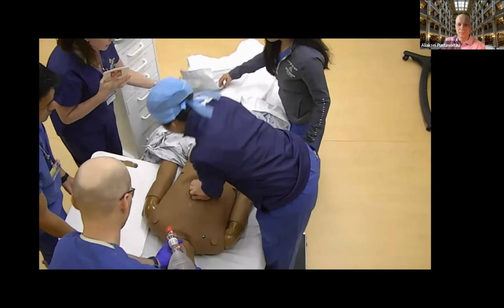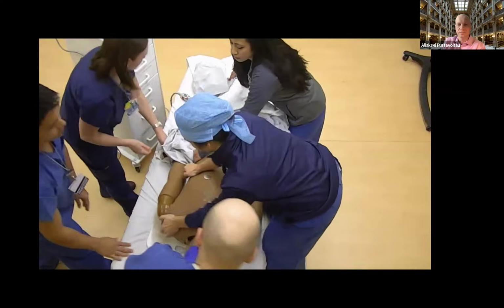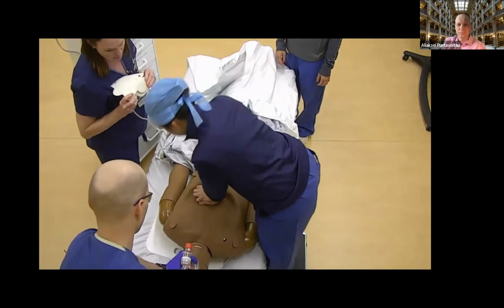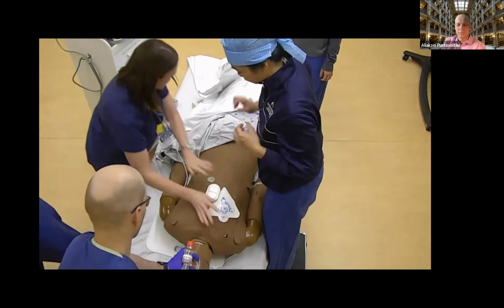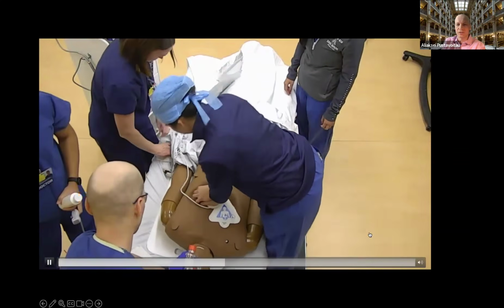Backward, back side ready, on your count. Yep, roll towards Rika. 1, 2, 3, roll. Good, give me compression. With the front pad, we're gonna put it out in 3, 2, 1. Good compressions. And you see it's placed in a way to free up the subcostal area for ultrasound.